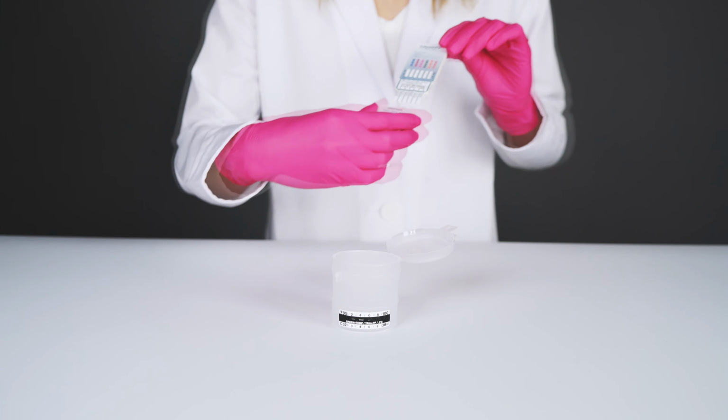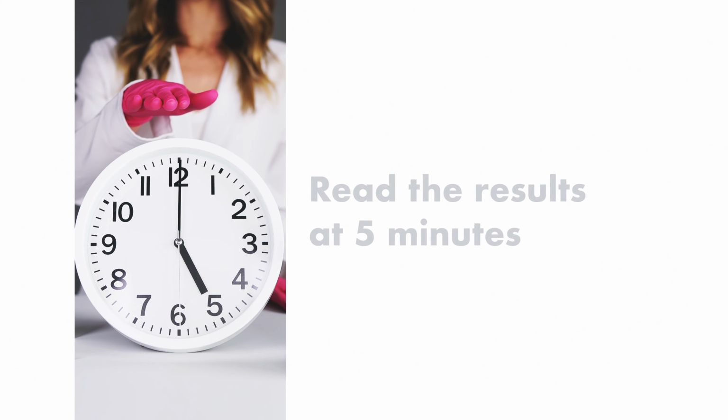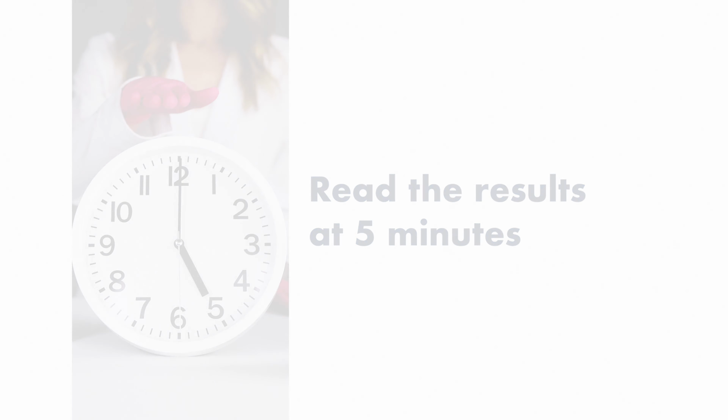Place the test card on a flat, dry surface. Start the timer and wait for the colored lines to appear. Read the results at 5 minutes.